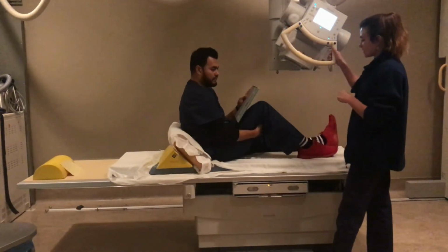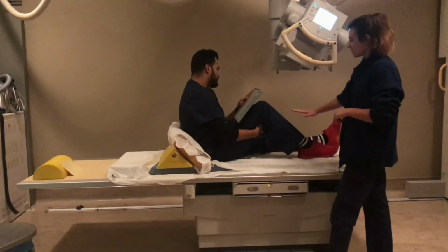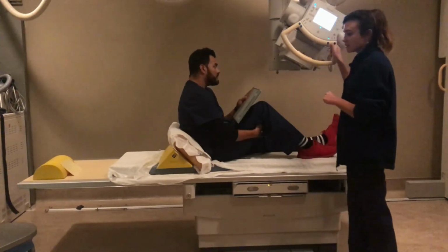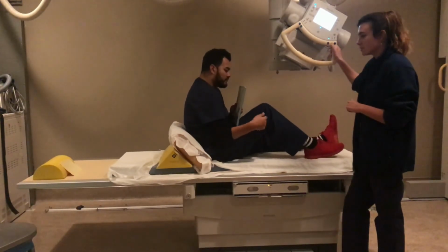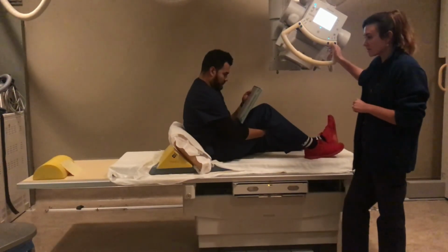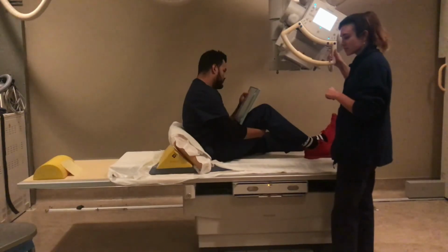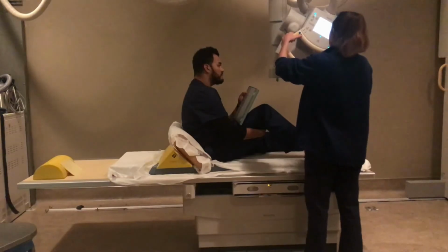So for this one, the central ray is also going to be perpendicular to the lower leg, and we're going to be shooting through the patellofemoral joint space. And for this particular projection, I would probably use 70 kVp at 4 mAs, since we don't have as much tissue to go through as the PA axial of the intercondylar fossa. So, I'm gonna scan.